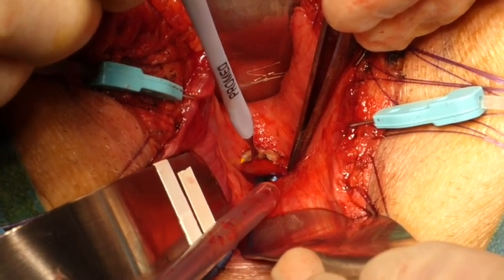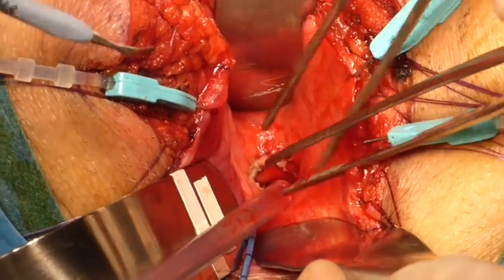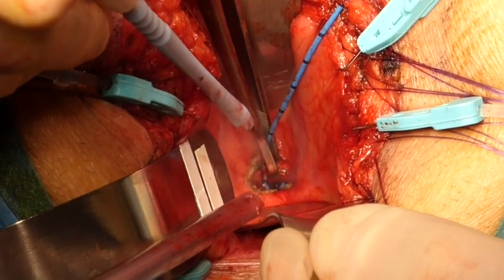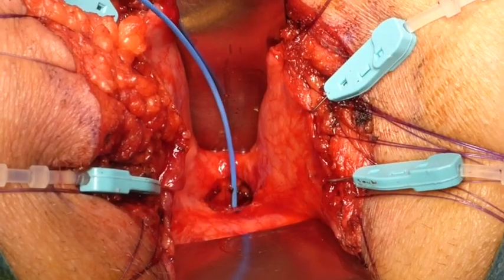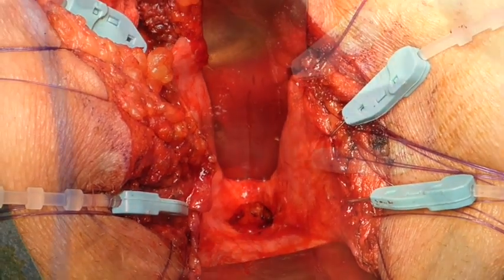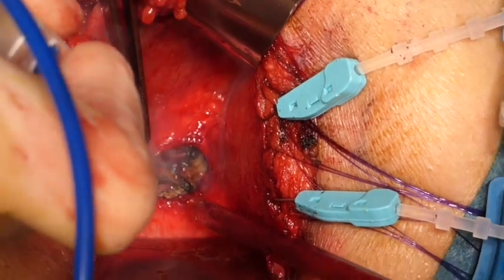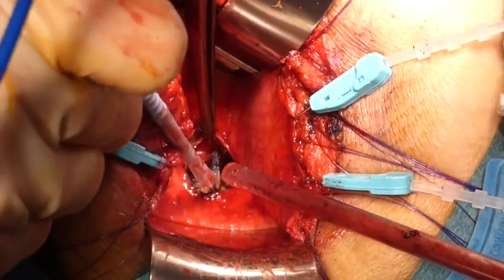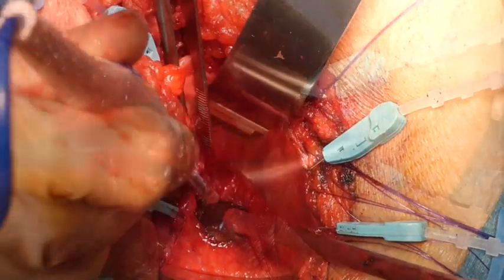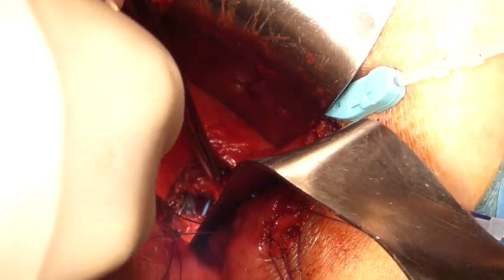The fistula's orifice and all the surrounding inflammatory tissues are excised. The ureteric catheter is removed and a dissection is performed to separate the rectal wall from the urinary tract. The fistula's defect is closed in three different layers with absorbable monofilament sutures.